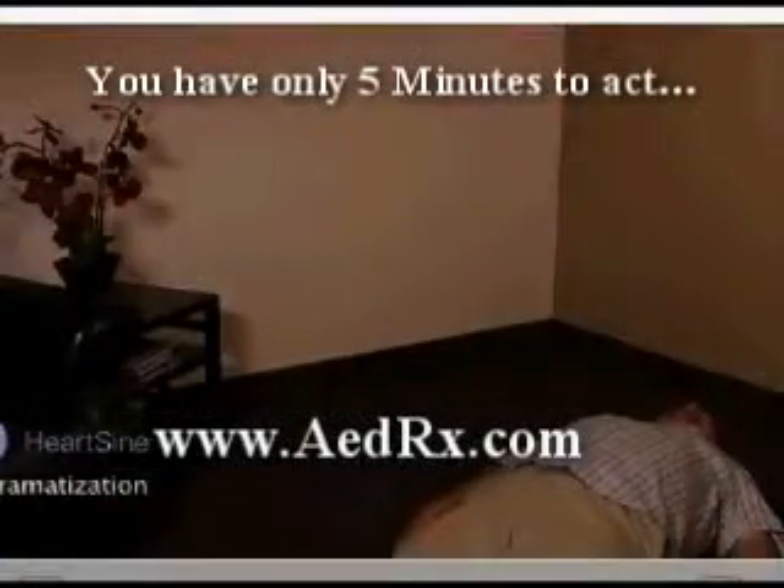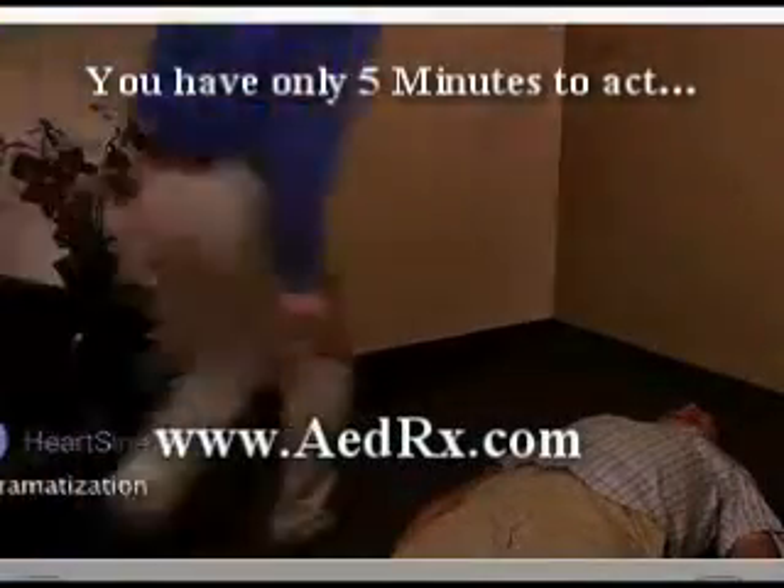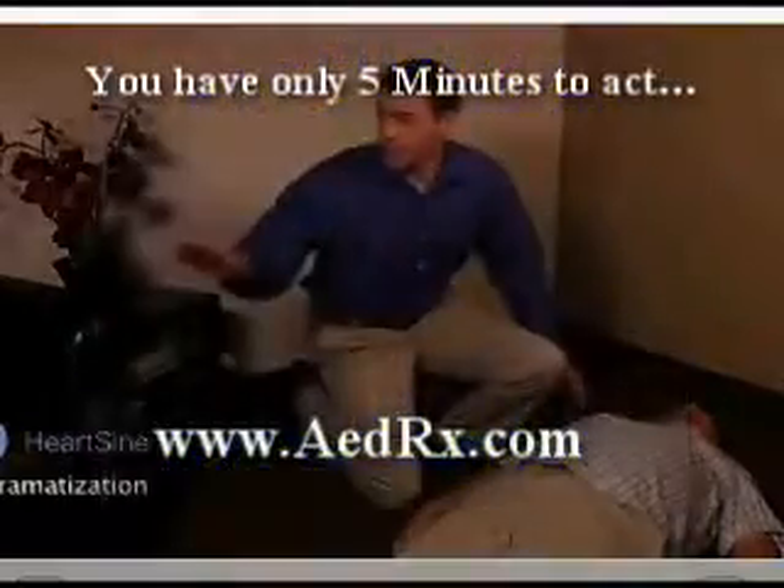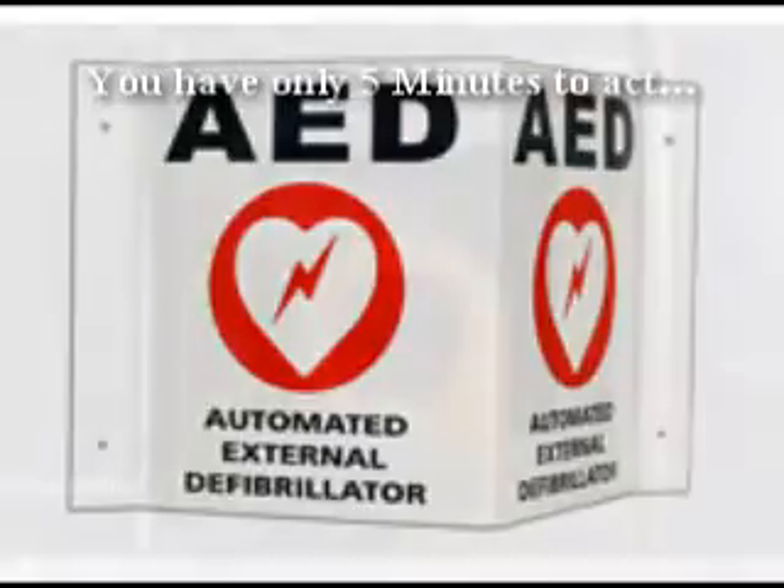Let's look at how to use the HeartSine Samaritan PAD. Jim, are you okay? He's not breathing. Call 911. Get the AED and then get the Samaritan PAD as quickly as possible.